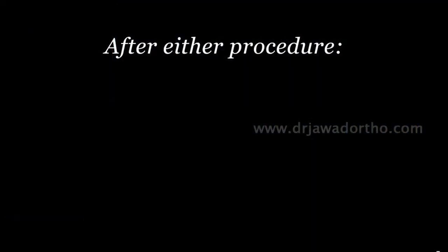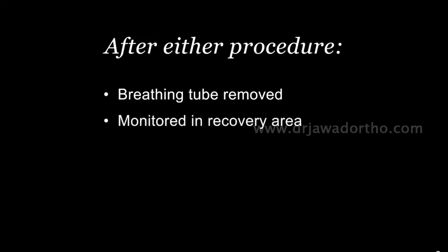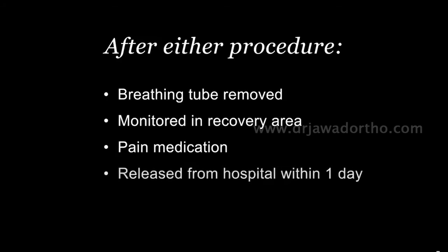After either procedure, your breathing tube will be removed if general anesthesia was used. You will be taken to the recovery area for monitoring. Pain medication will be given as needed. You may be released from the hospital the same day or within 1 day after either procedure.